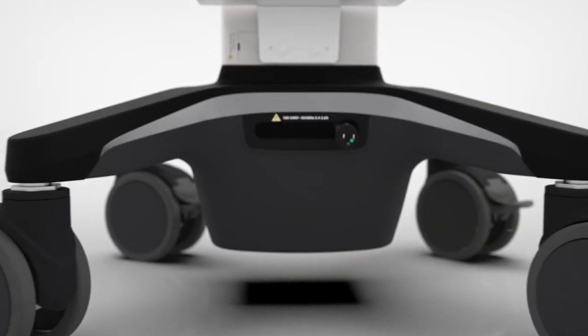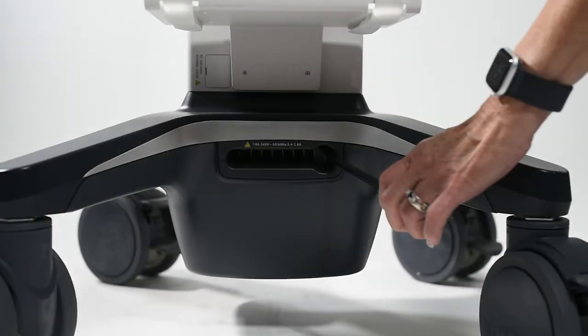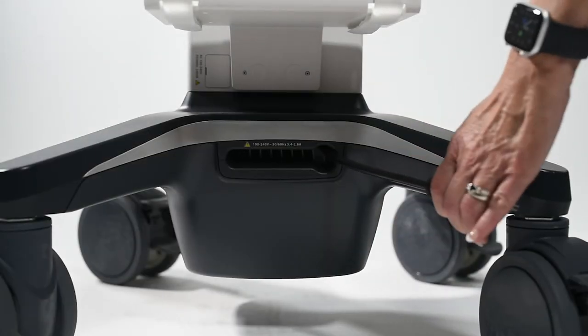The retractable power cable is located beneath the tray on the back of the cart. Pull the cord out to plug in the system and pull the cable to the side to lock the cord in place.